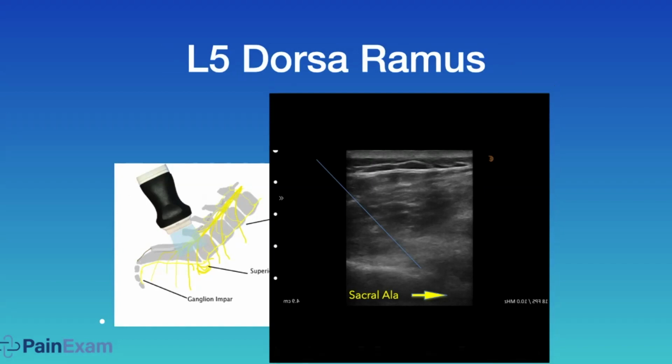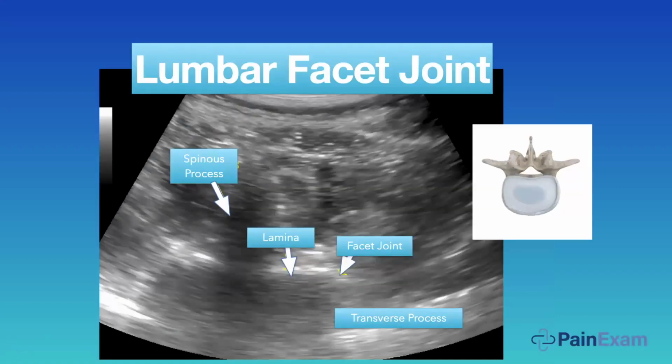If, let's say, I don't have access to the C-arm, and the patient's presenting with severe muscle spasm of the lower back, and I want to do a nerve block to that multifidus muscle, I'll do a dorsal ramus or medial branch block. If I just do a trigger point and I just want to get a little extra relief, I'll do that dorsal ramus injection as well. And by the way, anterior to the L5-S1 is the superior hypogastric plexus. Here's the sympathetic chain. Here's the ganglion impar, anterior to the coccyx.